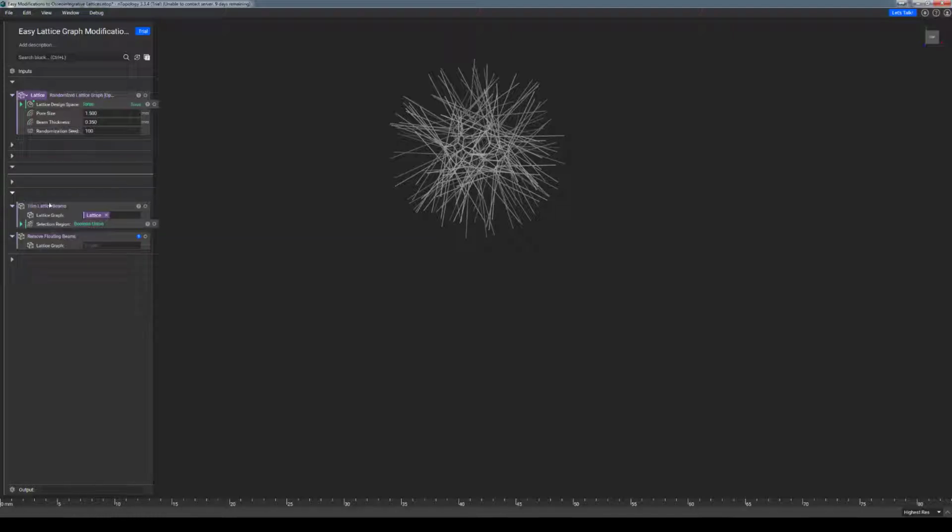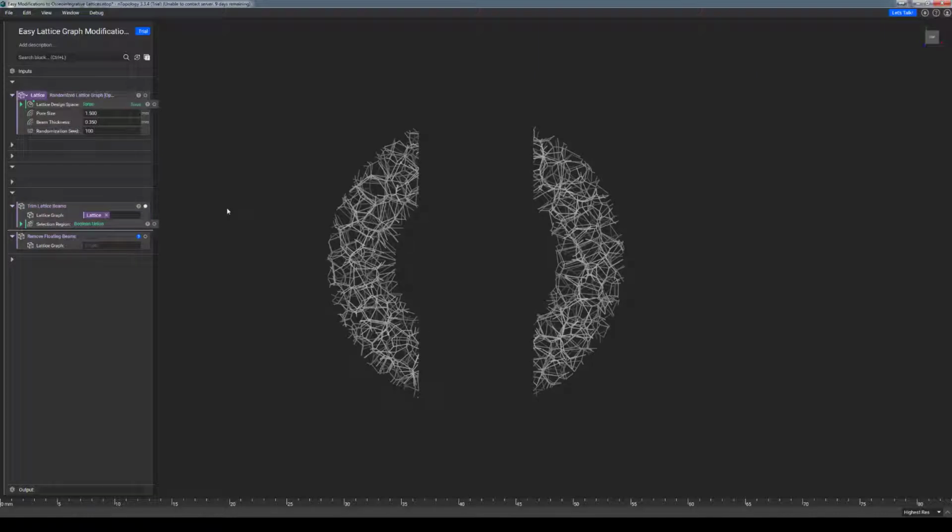Lastly, we have a lattice structure that has been more aggressively trimmed, leaving not just open beams, but also floating ones, ones that we can see over here and down here. Now these are disconnected from the rest of the lattice structure entirely, and in the case where we want to remove these floating beams, we have a custom block here called Remove Floating Beams that accepts a lattice graph input.